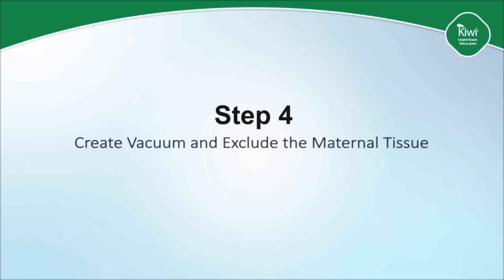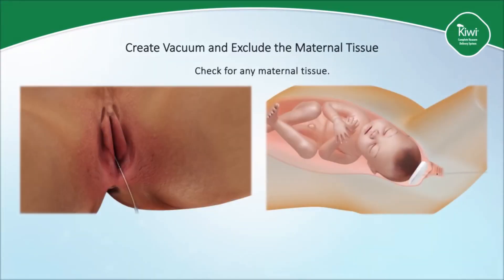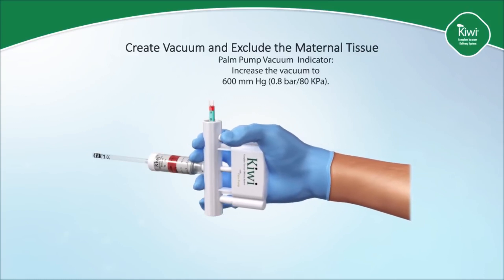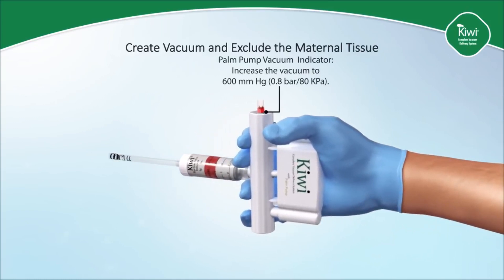The key during this step is to ensure that the cup is moved along the midline of the maternal pelvis and avoid the natural tendency to push the cup laterally. Step four is to create vacuum and exclude the maternal tissues. Initiate cup seal by increasing the vacuum using the palm pump. Check that no maternal tissue is trapped underneath the cup by gently sliding one's finger around the anterior and lateral portions of the cup. There is no need to check posteriorly as maternal tissue will rarely be trapped there. Increase the vacuum to 600 millimeters of mercury, 0.8 bar, or 80 kilopascals — that is the top of the green zone.